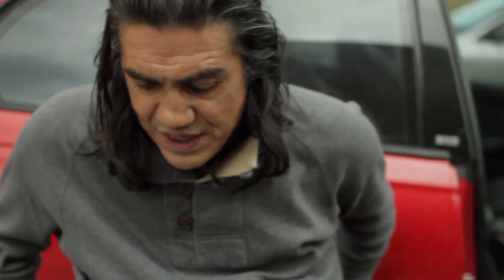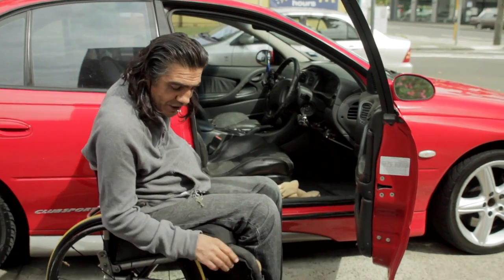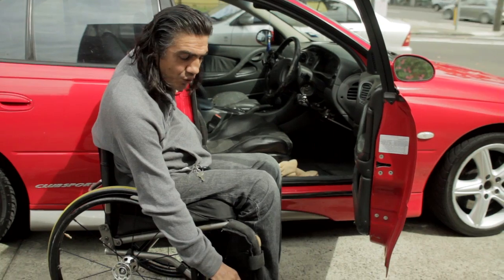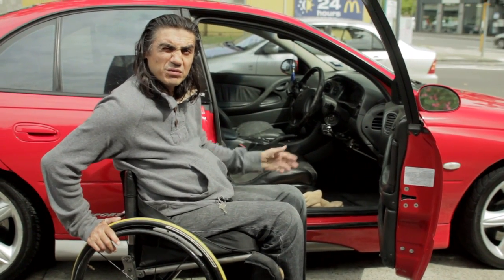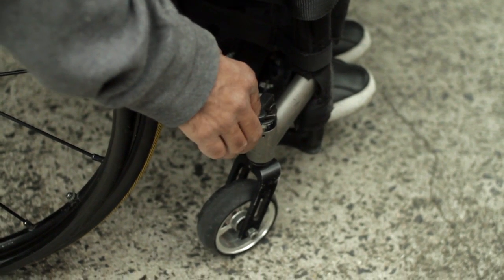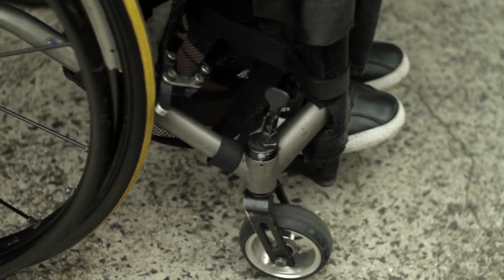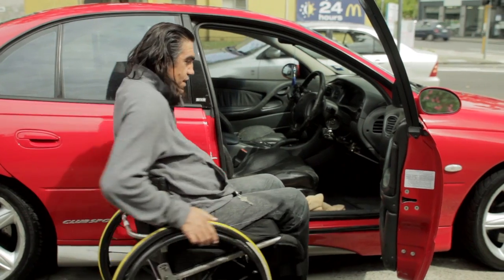So before I jump into the car, I've got a thing called a caster lock, and what they do is they lock the front wheel, and that makes sure when I'm transferring into the car, the wheelchair won't slide across. So it's pretty simple. Once I lift this lever up, the wheel will turn until it gets into that position, and now it's locked. It's not moving at all.